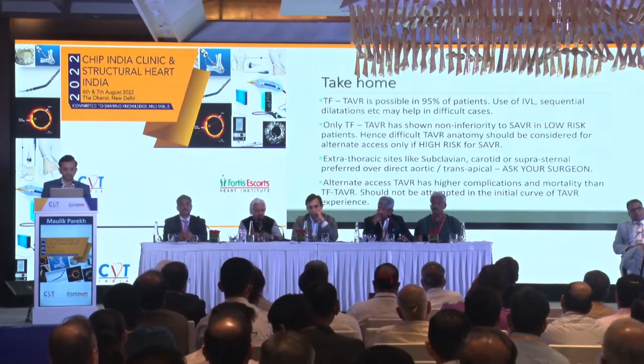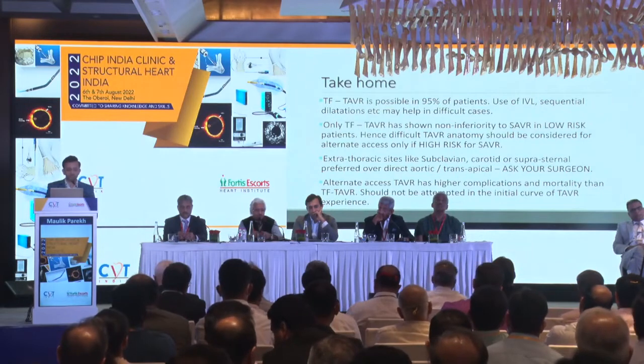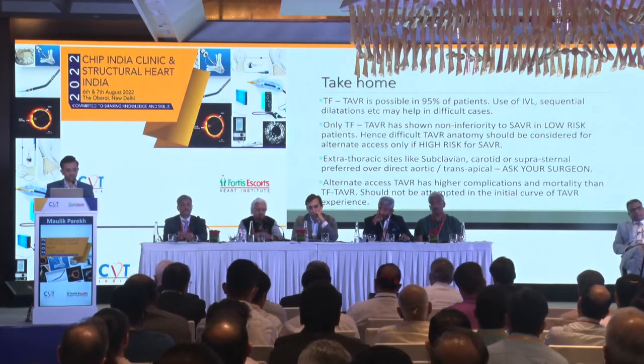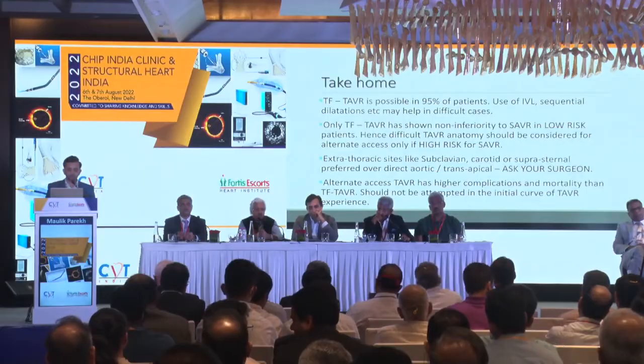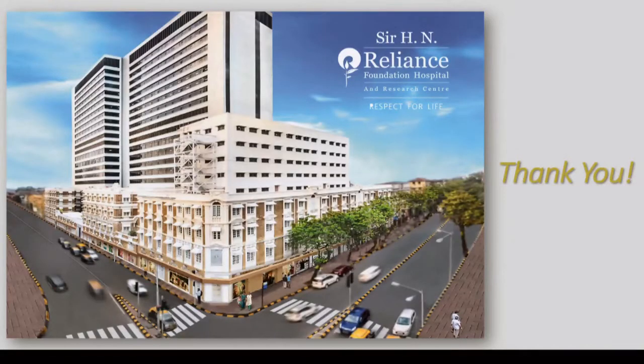and everything. So take home, transfemoral TAVR is possible in 95% of the patients. Use of IVL and sequential dilatation may help in difficult cases. Only transfemoral TAVR has shown non-inferiority to SAVR in low-risk patients. Hence, difficult TAVR anatomies should be considered for alternate access only if high risk for open heart surgery. Extrathoracic sites like subclavian, axillary, carotid and suprasternal are preferred over direct aortic or apical. Ask your surgeon what is his comfort. Alternate access TAVR has higher complication and mortality than transfemoral TAVR and should not be attempted in the initial curve of the TAVR experience. Thank you very much.